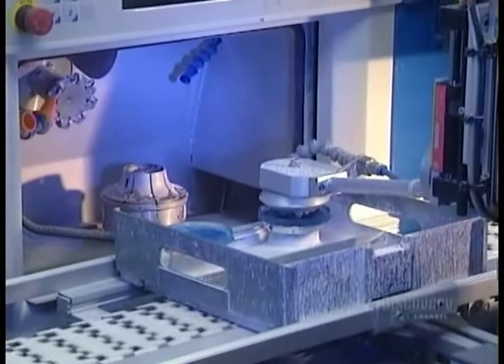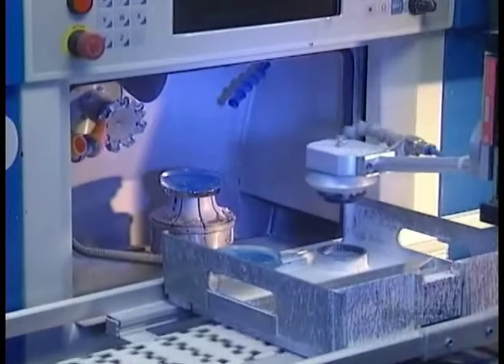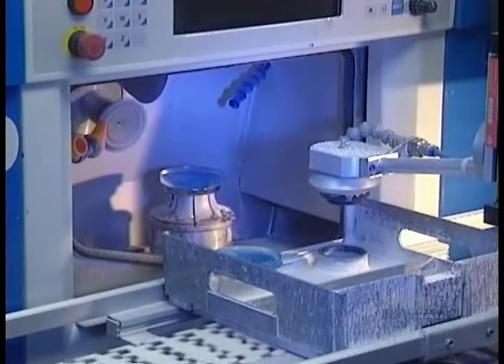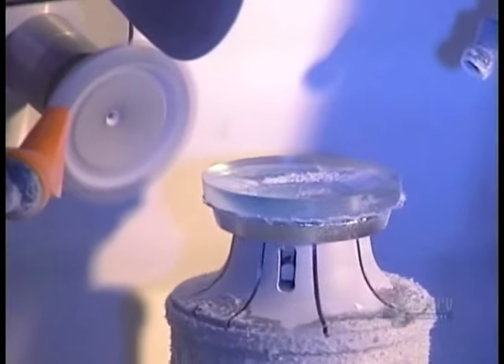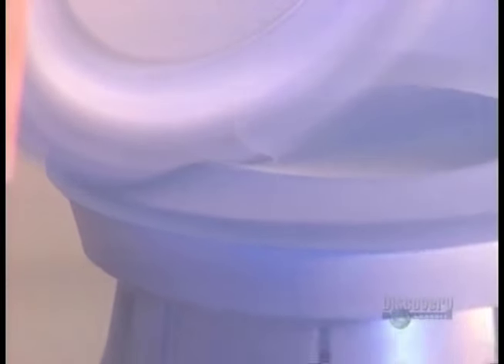At this point, robots take over. When the tray with the discs arrives, the milling machine reads the prescription information, then reshapes the plastic accordingly. First, it thins the disc and shaves it down to a smaller diameter. Then, it creates the required curvature. The disc is now a lens.